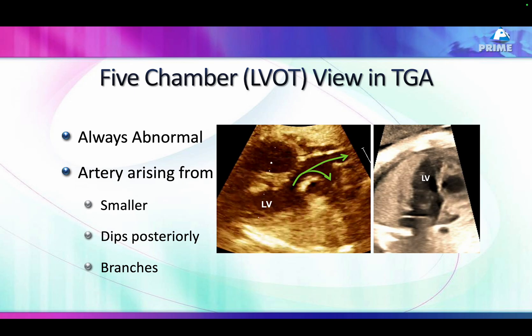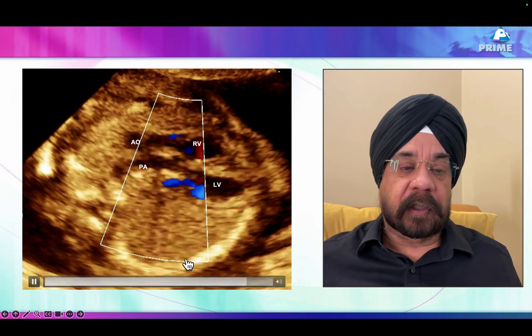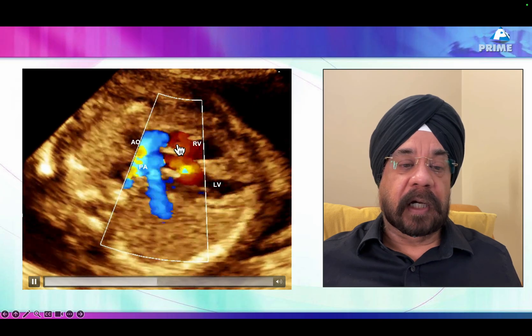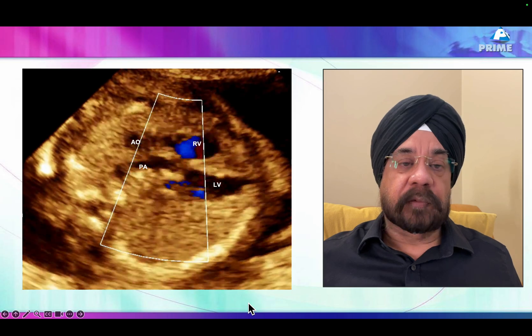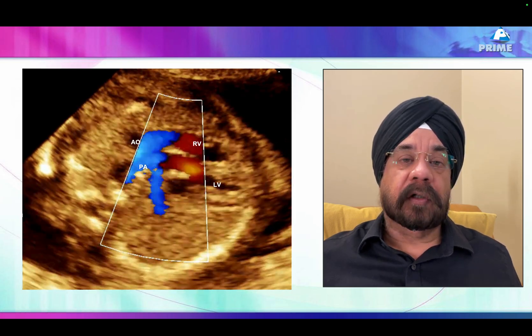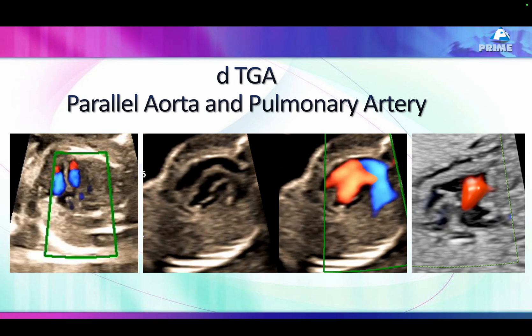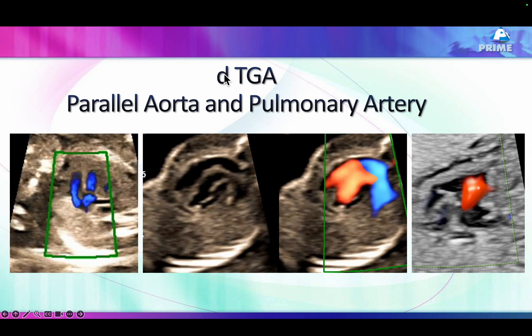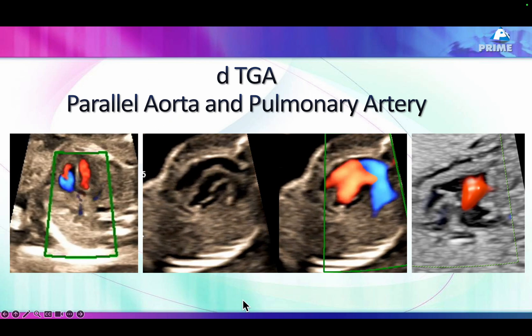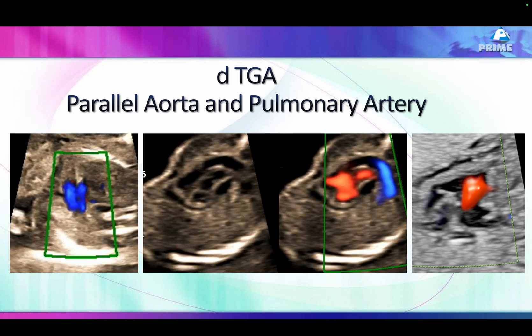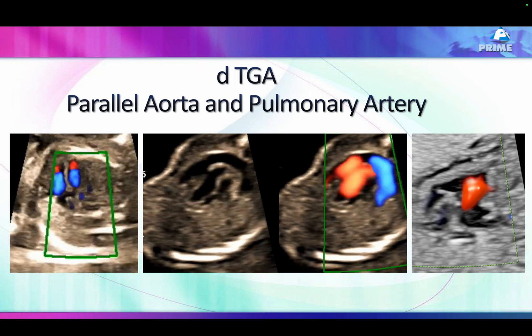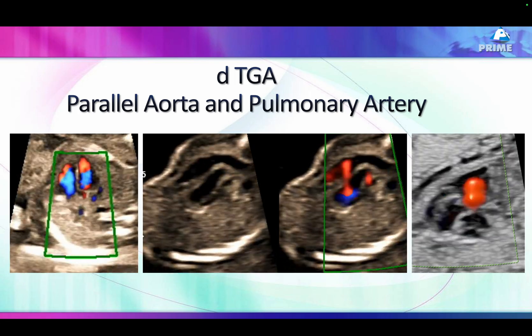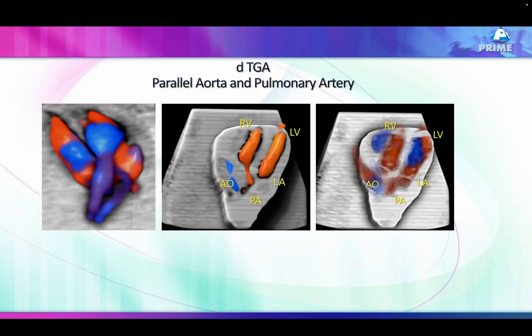This clear-cut view is not seen in most cases. What I'm trying to show you is the branching of the artery which is smaller — the branching vessel is the pulmonary artery, and the aorta is not branching. This is the same sign we use in adult or neonatal echo to diagnose TGA. But when this sign is not clearly visible in fetal echo, we rely on indirect signs. One indirect sign is vessels that are parallel to each other — they are not crossing.